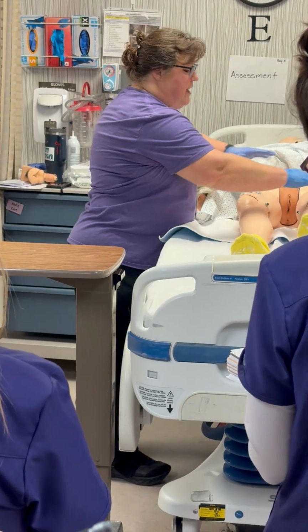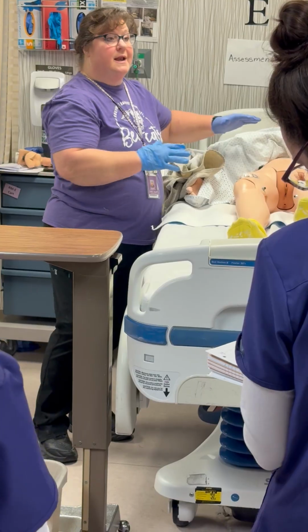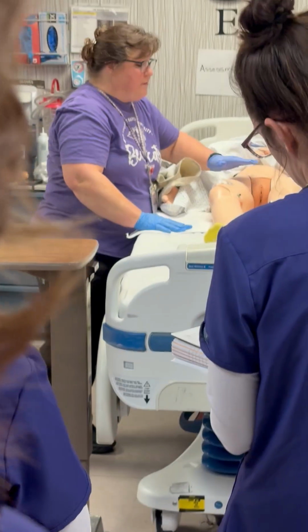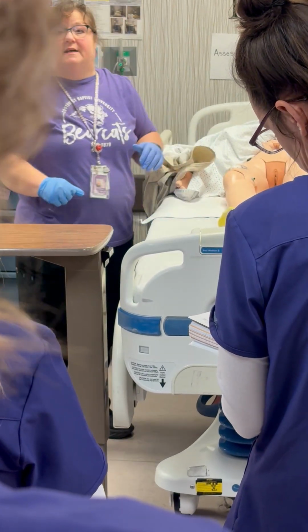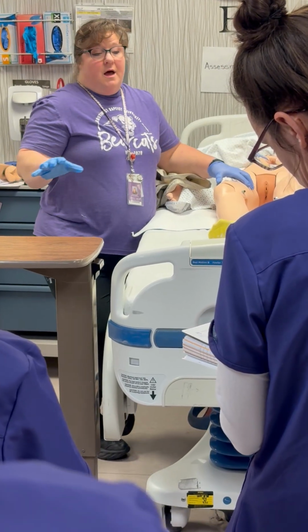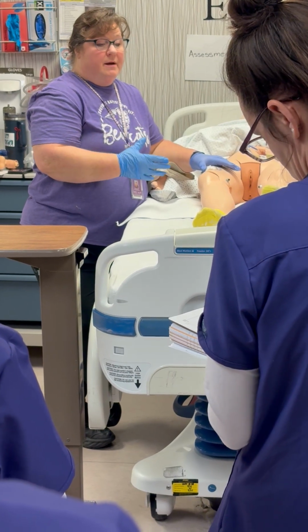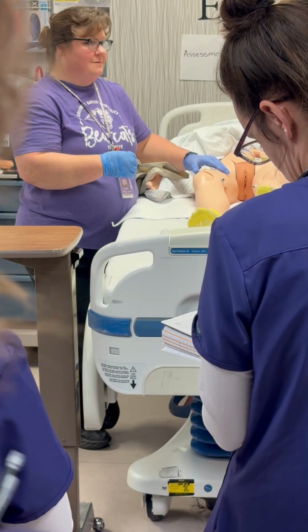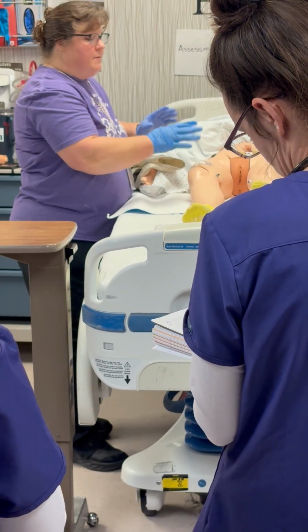So you're doing all of that pericare, and you don't really have to do it. You just have to tell me you're doing it and how you're doing it, okay? So I'm gonna do pericare. I'm gonna wash from the abdomen to the knees, inner thighs, peri area, and then anus last, just like that, okay? Yes, it does come. Most catheters come with wipes. So when we talk about pericare, the most appropriate pericare is doing it with soap and water. Okay? All right?